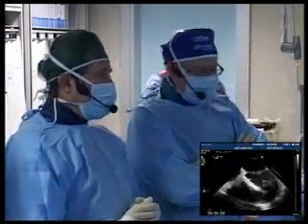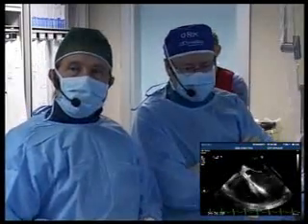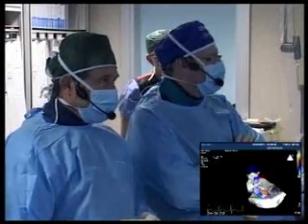Okay. I mean, we both, Kevin and I, are likely to use a muscular VSD occluder. Let me, Mario? Yes. Just hold on a second. Let me just pick on one or two people first.